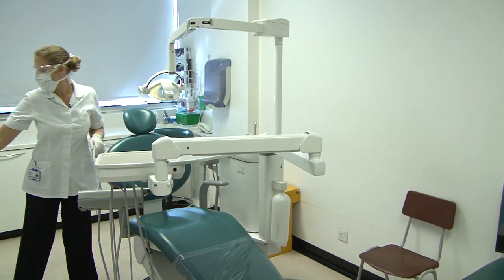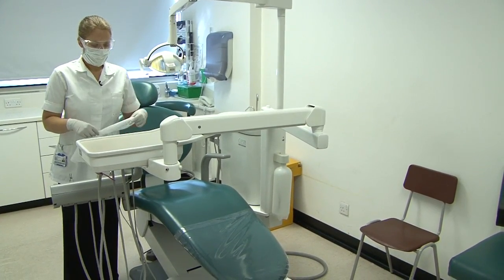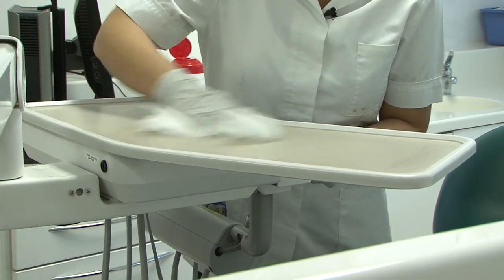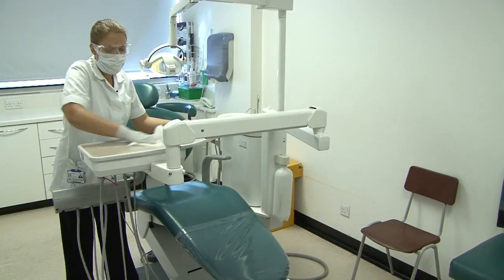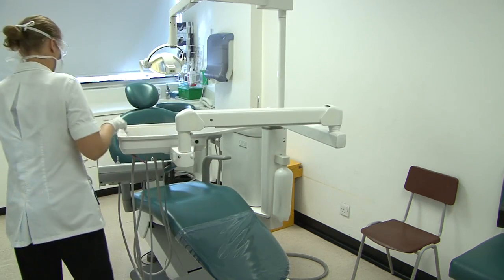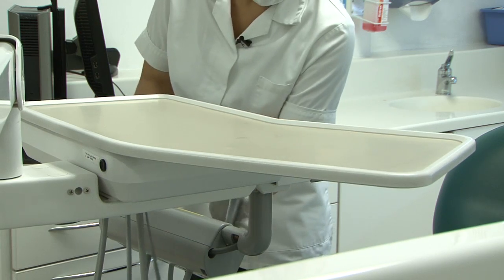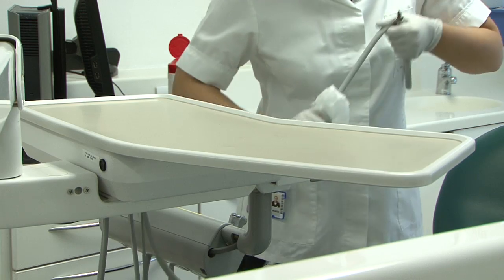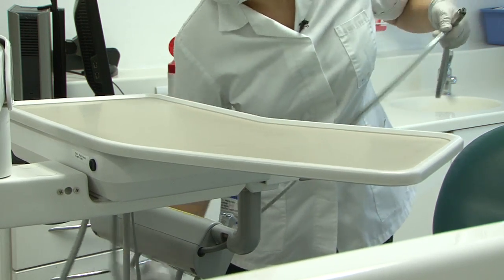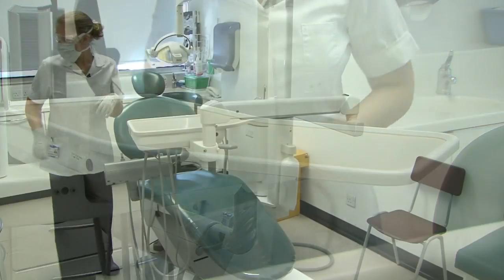I dispose of my azo wipe and I do the bracket table section. I wipe the switches and the handle, the actual bracket table, as well as the arm. Then take each of the hand instruments out and wipe along the entire cable. I dispose of my azo wipe again.